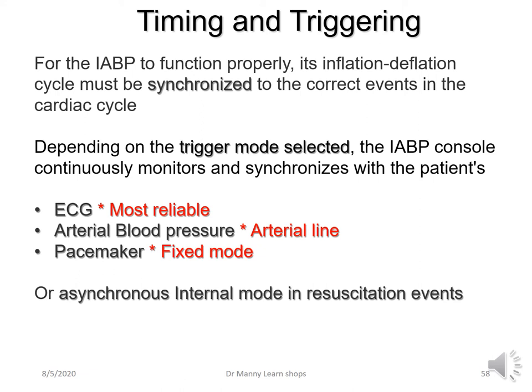And depending on the trigger mode selected, the IABP console continually monitors and synchronizes with either the patient's ECG, which is considered the most reliable, the arterial blood pressure waveform, the arterial line, and the pacemaker, which has to be in fixed mode if it's being used. And in certain resuscitation situations, you can use an asynchronous internal mode, which again, we're not going to cover in this session. But basically, you can just set the pump in an asynchronous mode while you're doing CPR.